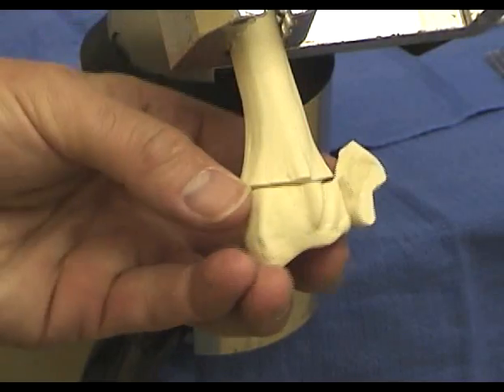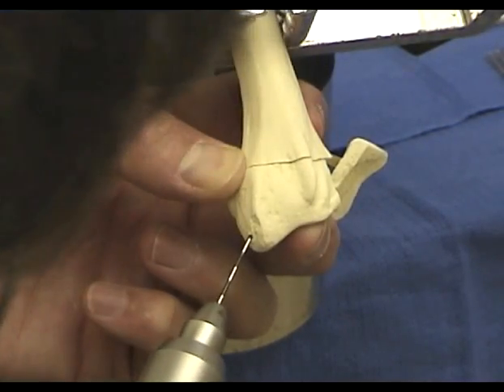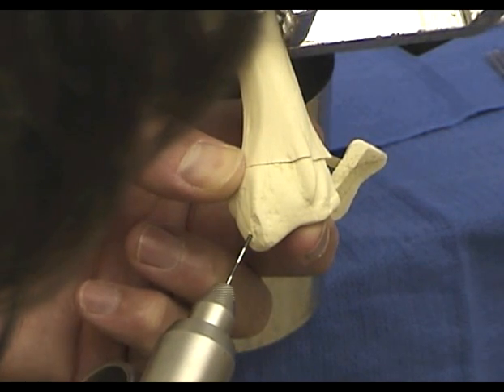This sawbone shows a radial column and ulnar corner fragment. The transtyloid pin is started in the flat area of bone dorsal to the first compartment and directed to the interosseous membrane.